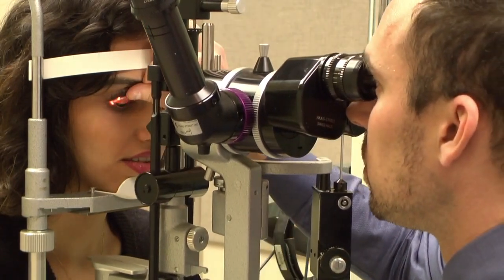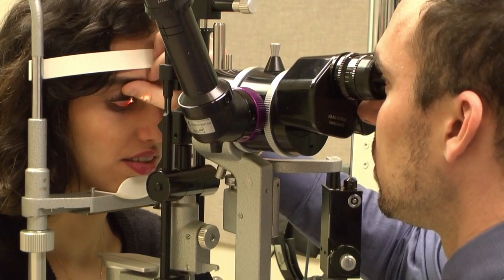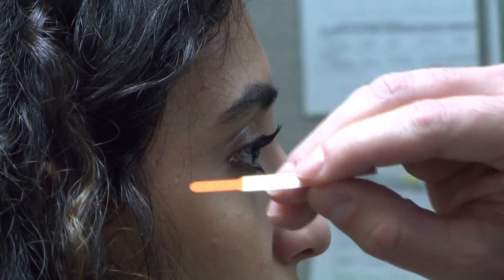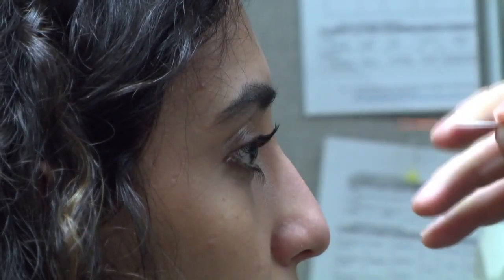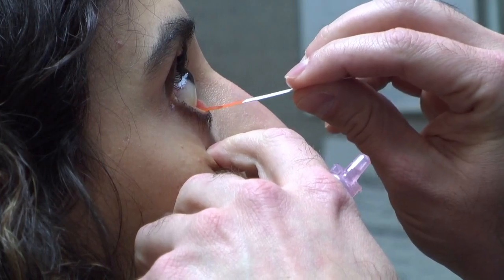At the same time, apply downward pressure while pulling the eyelashes up. If the eyelid won't stay everted, you can try to pin the eyelashes to the superior orbital rim. To instill fluorescein, take a strip from the packaging. Drop a single drop of saline onto the strip, and touch the strip to the inferior palpebral conjunctiva.